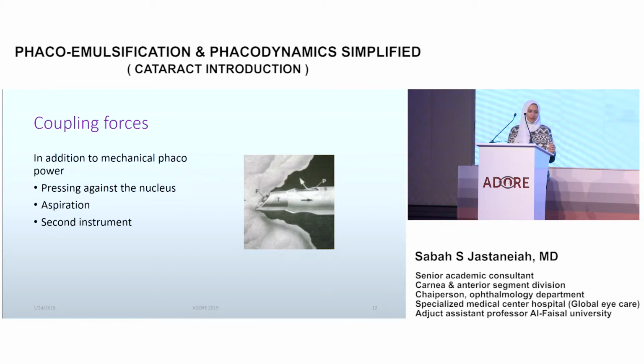Another thing that helps with emulsification is the coupling forces, the forces you use against the pressure against the nucleus, the second instrument, and other things that you utilize to help mechanically with the emulsification.